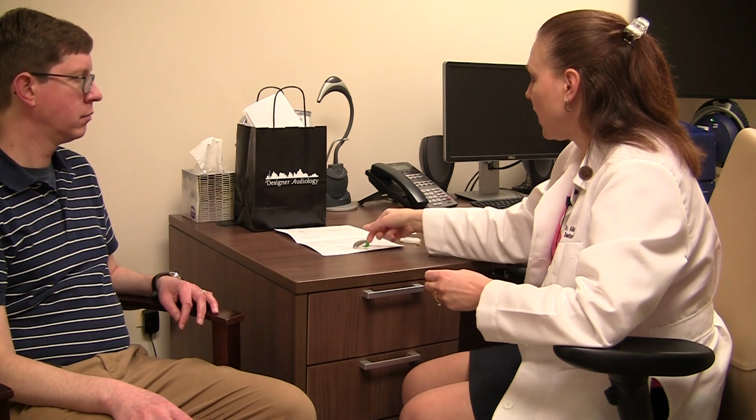This button down at the bottom is a volume control. Most people don't really ever use it anymore because the hearing aids have gotten pretty good at adjusting, but if you need to, it's a rocker switch. So if you press the up part, it will make things louder, and if you press the down part, it'll make things quieter. For both the programs and the volume, if you touch it on one side and you're wearing the hearing aids together, it will automatically change on the other side. So you don't have to do both at the same time. It will do them as a pair when you touch them. Good? All right.